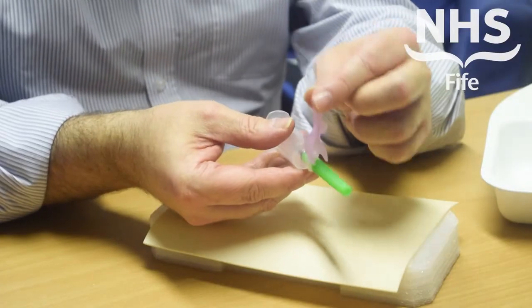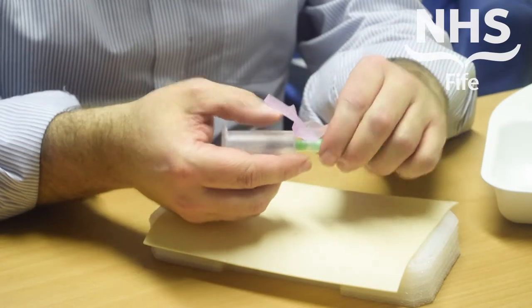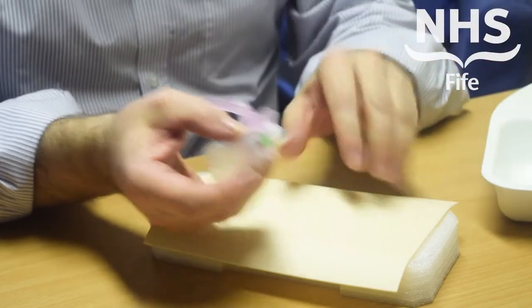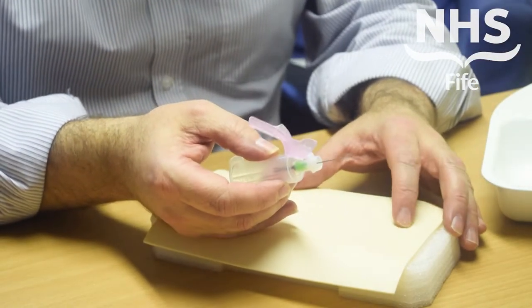To use the device, pull the plastic cover back as far as possible. Remove the needle protective device. Again, that can go into your normal domestic waste — there's no need for that to go into the sharps bin.